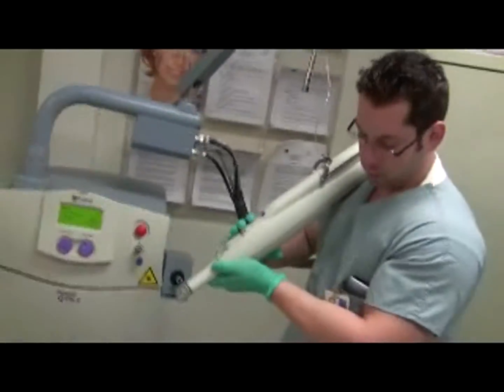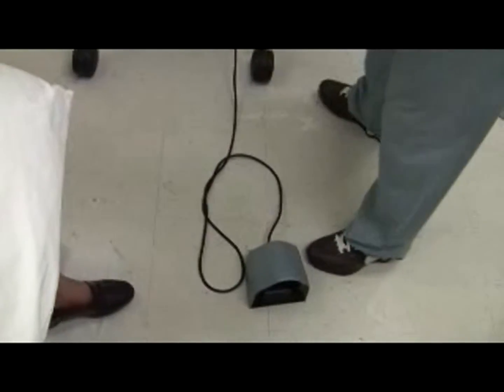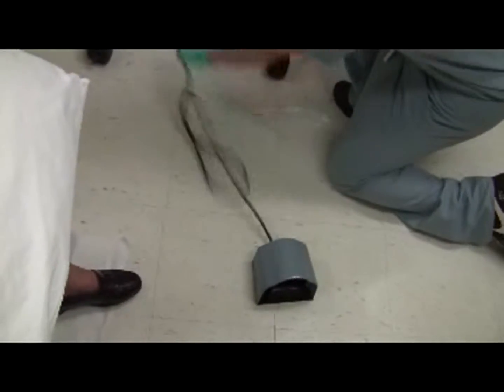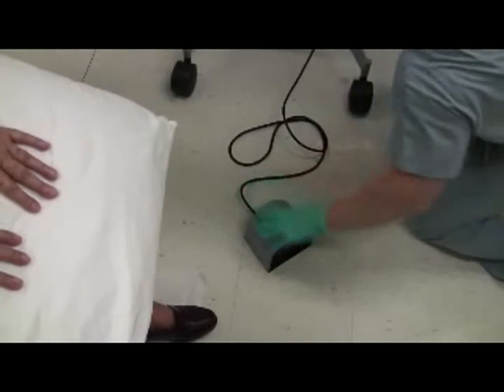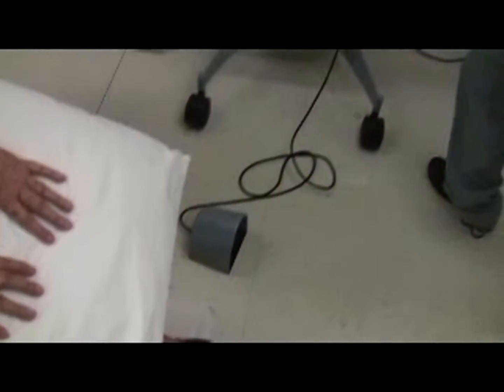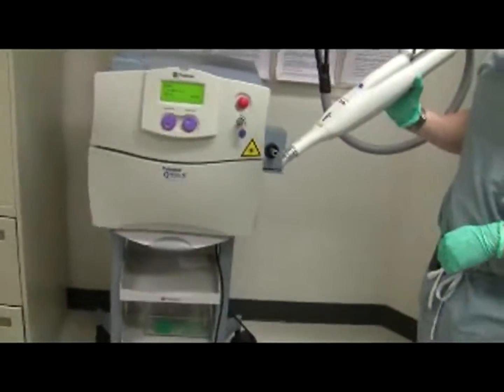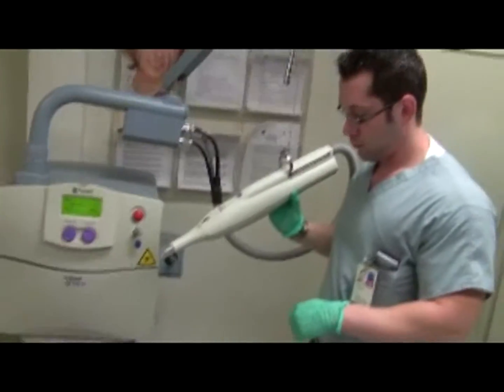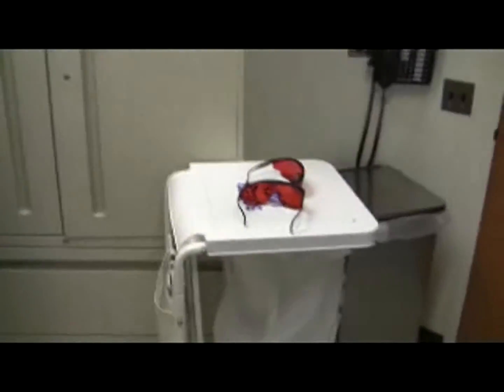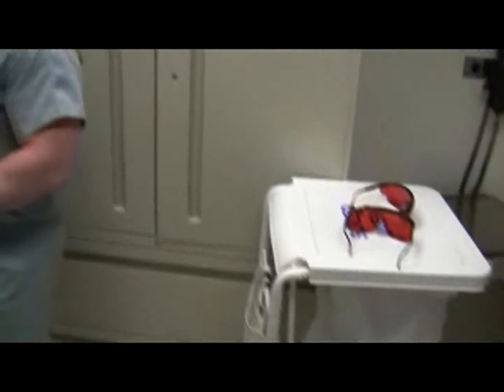Position the foot pedal so you can press it comfortably. If we're touching the foot pedal with our glove, we're going to change the glove. Press the emission ready button — get a fresh glove while reading.